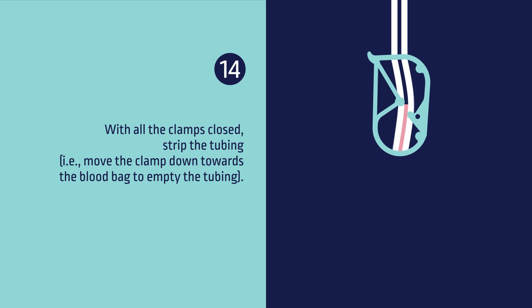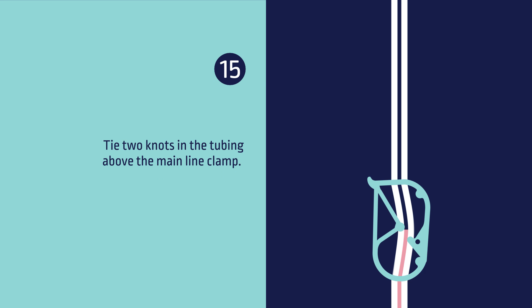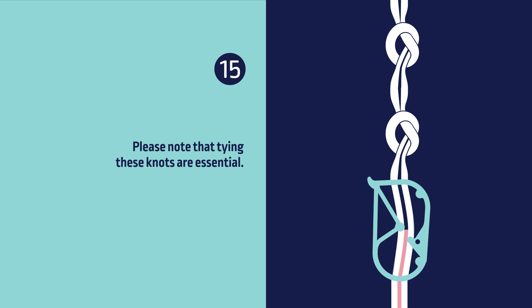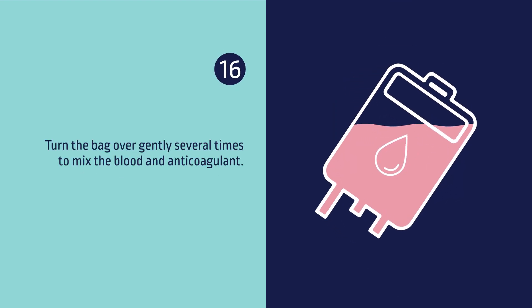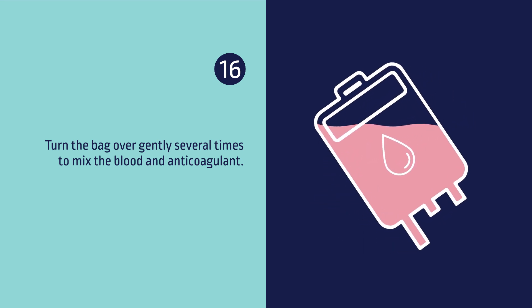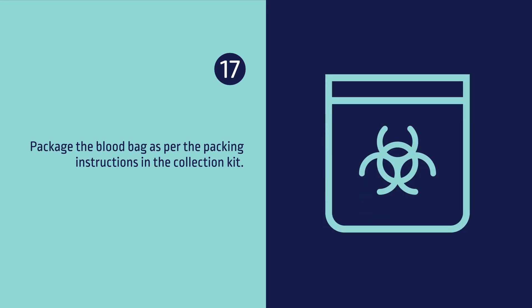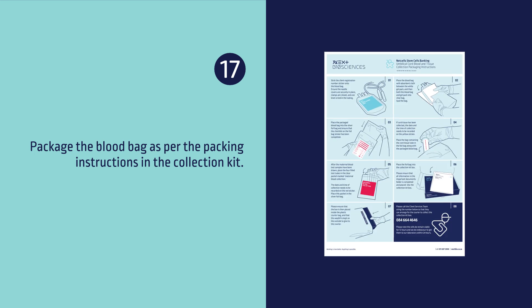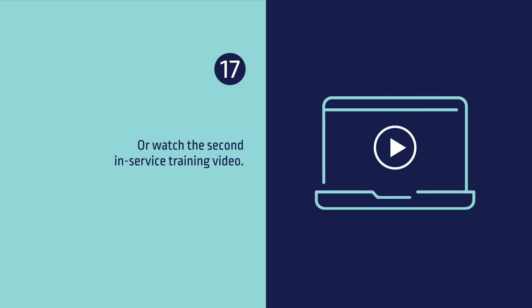Step 14: With all clamps closed, strip the tubing. Step 15: Tie two knots in the tubing above the main line clamp. Please note that tying this knot is essential. Step 16: Turn the bag over gently several times to mix the blood and anticoagulants. Step 17: Package the blood bag as per the packing instructions in the collection kit, or watch the second in-service training video.